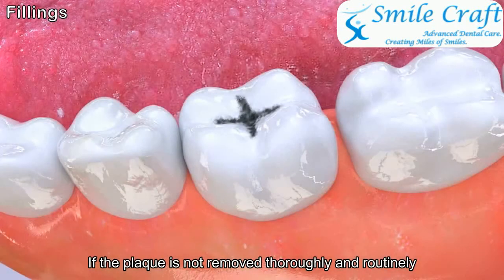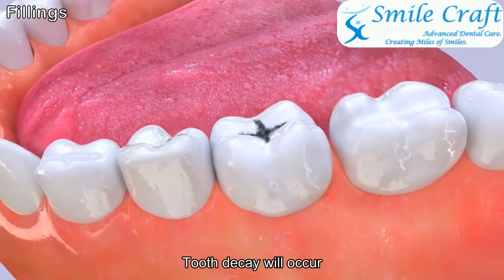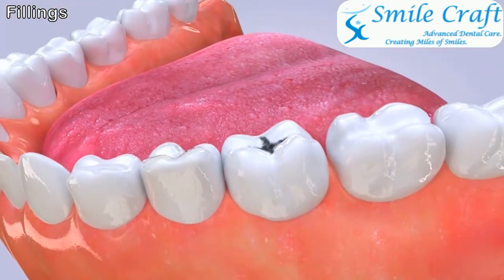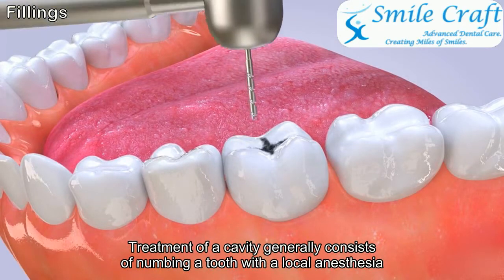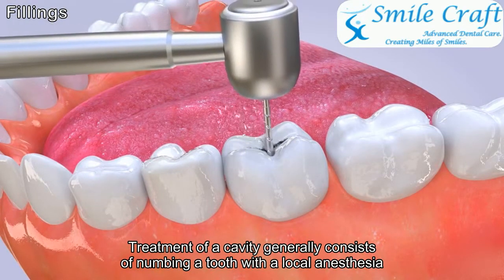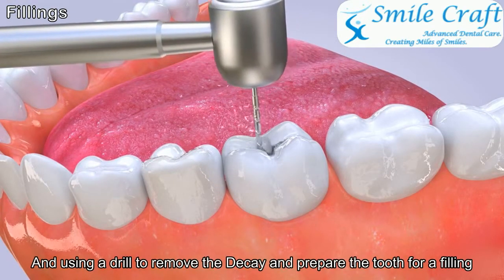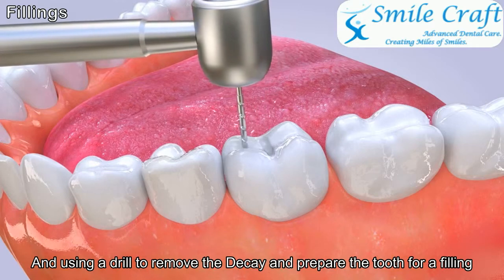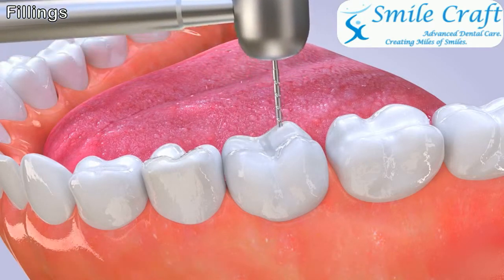If the plaque is not removed thoroughly and routinely, tooth decay will occur. Treatment of a cavity generally consists of numbing the tooth with a local anesthesia and using a drill to remove the decay and prepare the tooth for a filling.